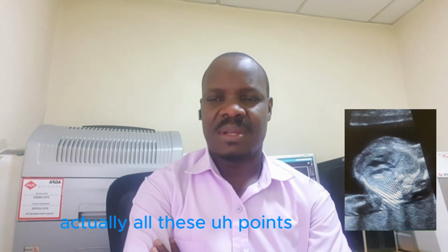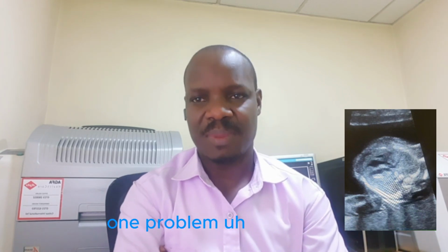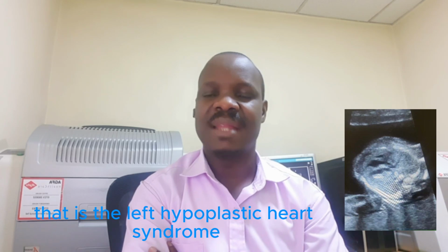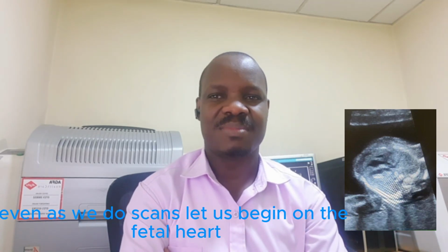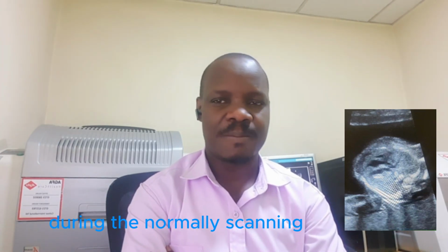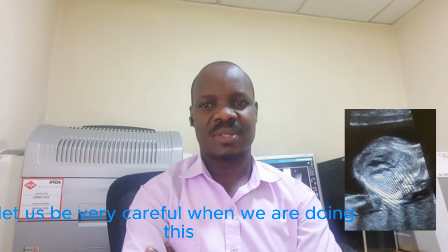Actually, all these point towards one problem, and that is the left hypoplastic heart syndrome. So sonographers outside there, even as we do scans, let us be keen on the fetal heart, especially when you're doing fetal echo during the anomaly scanning. Let us be very careful when we are doing this.